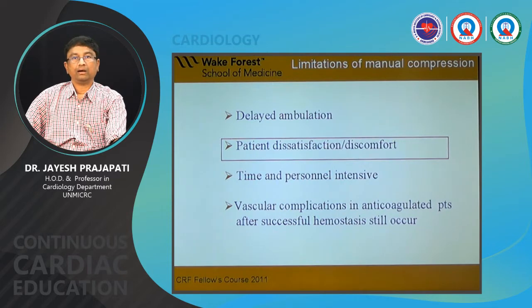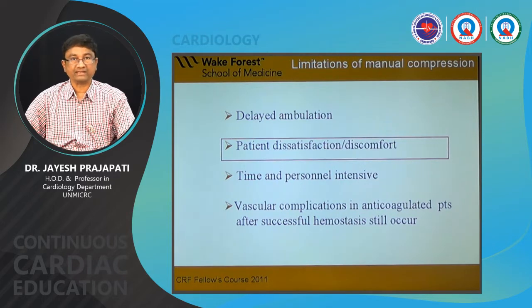And of course, sometimes with a small hematoma they squeeze, and the patient comes later with too much tissue necrosis and a large ulcer. So sterility should be maintained. The skin should always be prepared before femoral puncture. I'm not going into detail, but the local site should be prepared properly. There should not be any fungal infection, and the groin should always be clean and properly sterilized with a good amount of betadine or whatever you are using. So sterilization should be proper. Otherwise, local site infection is the worst thing.